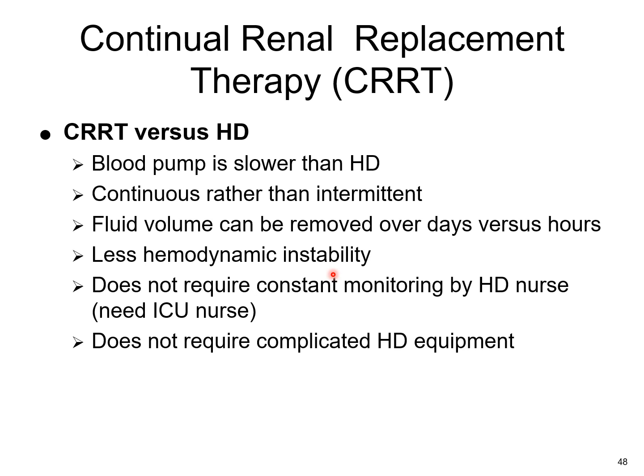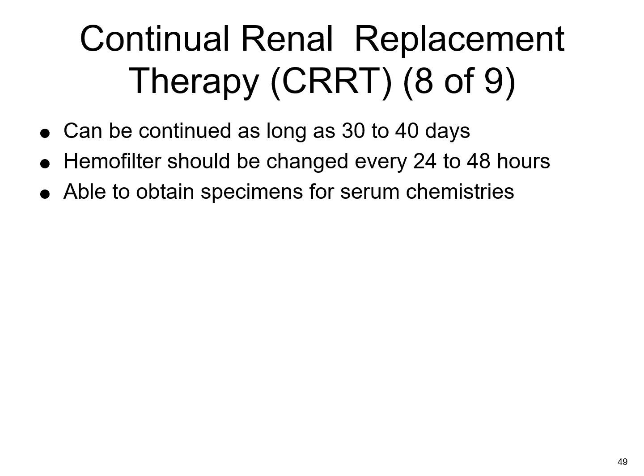You do not require constant monitoring by the hemodialysis nurse, where, like we said, that hemodialysis nurse is like an ICU nurse, and it does not require complicated hemodialysis equipment. So it can be continued as long as 30 to 40 days. Hemofilter should be changed every 24 to 48 hours. And one of the other things about CRRT is that they can obtain specimens for serum chemistries.